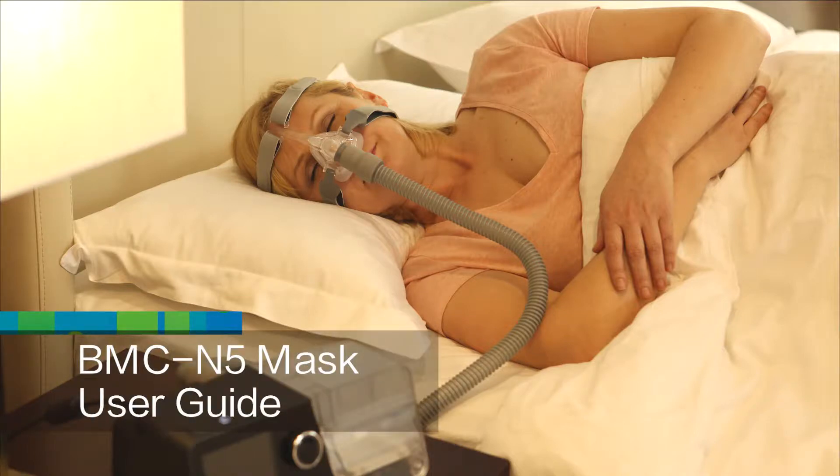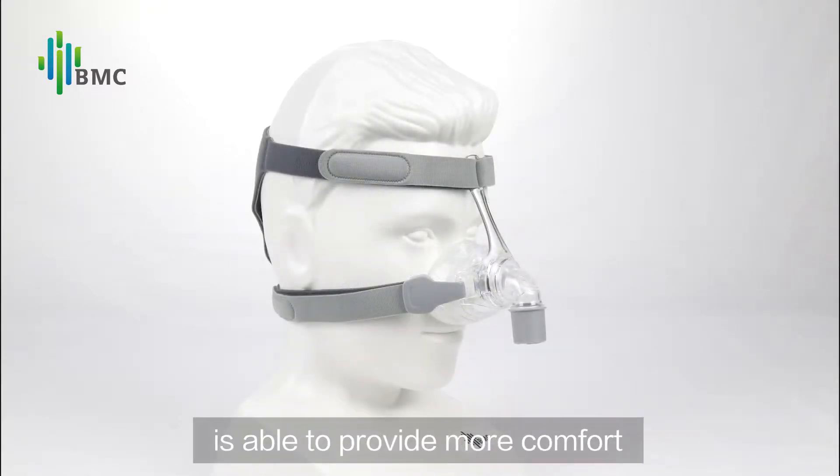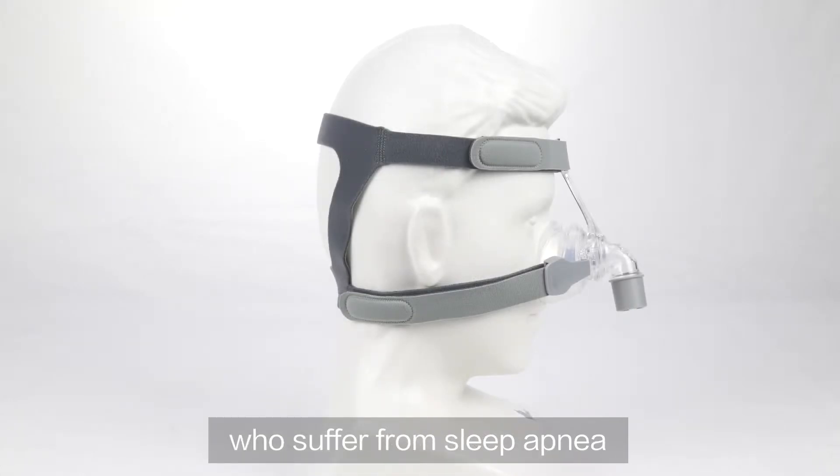BMC N5 Mask User Guide. The N5 is an easy-fitting nasal mask able to provide more comfort. It is suitable for patients who suffer from sleep apnea.